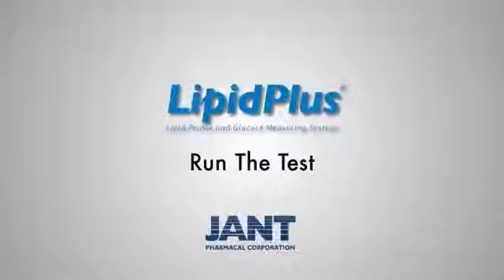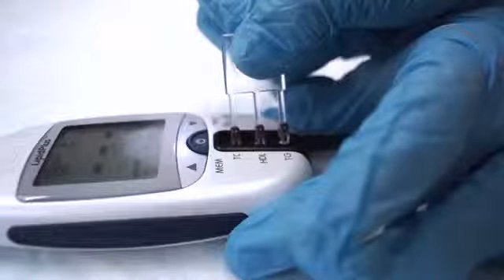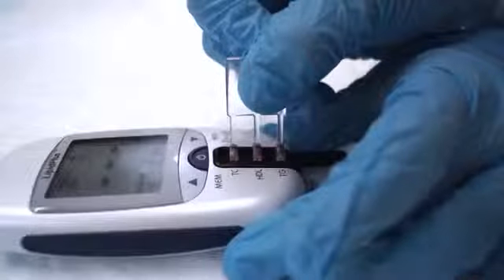Run the test. After the first, second, and third capillary rods have been filled, apply the blood sample to the 3 test areas of the lipid panel strip at the same time, starting at a 45-degree angle. Then move the capillary rods to a 90-degree angle. Never reuse the capillary rod or reapply it to the finger after it has touched the test strip or analyzer.